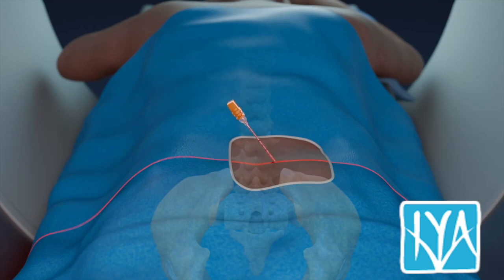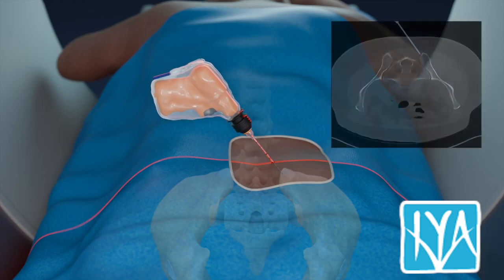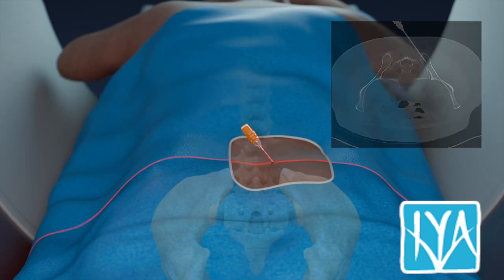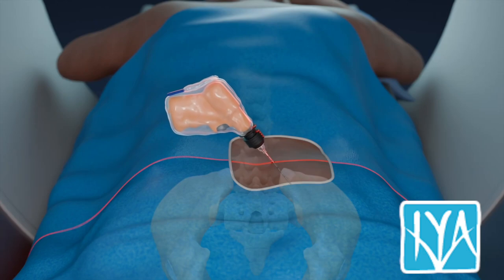Based on the planned trajectory, the biopsy needle is advanced through the skin toward the bone under intermittent CT guidance. Serial scans are used to confirm the position of the needle tip as it enters the cortical bone. Similar to the fluoroscopic technique, bone marrow aspiration is performed, followed by obtaining a core tissue sample.